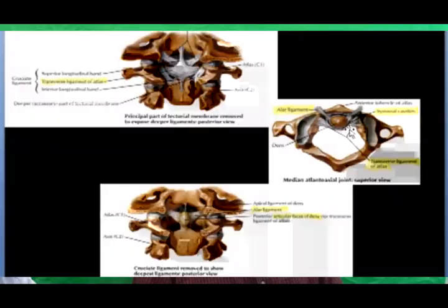But how do you get realigned? We've taken three trips out there, but it's kind of difficult to get Carol out to New York. And you're asking how do we do the realignment? Yeah, you're looking at the craniocervical junction, and this is the dens bone right here of C2, and it's going into C1.